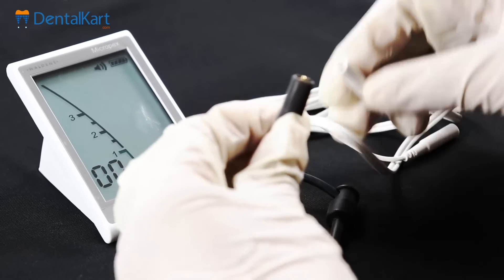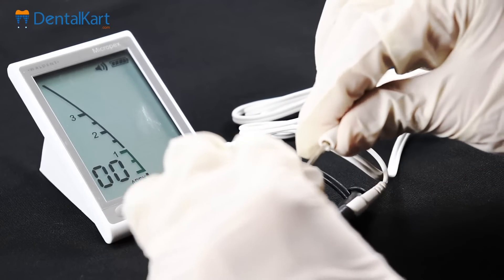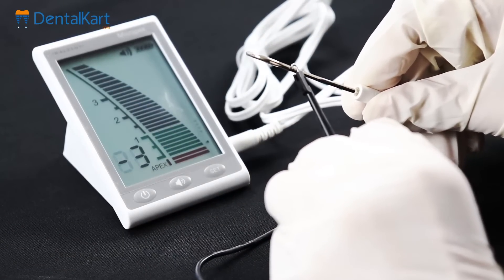Connect the file clip to one end of the measuring wire and connect the lip hook to the other end of the measuring wire. Now attach the clip to the end of the lip hook, and the reading should be minus 3.